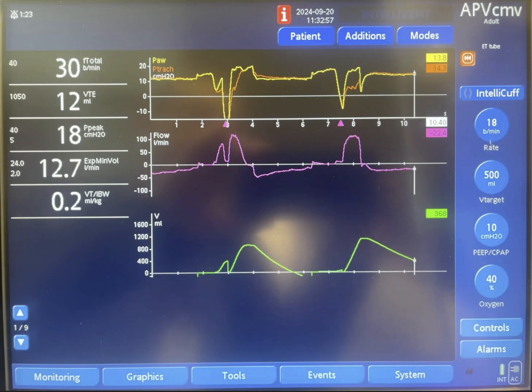It is set up at a rate of 18 with a PEEP of 10. You can see here PEEP is around 10. Starting from the left, this is expiration — you can see expiratory flow going up to zero. At this point the pressure rose; it looks like a ventilator-initiated breath with positive pressure.